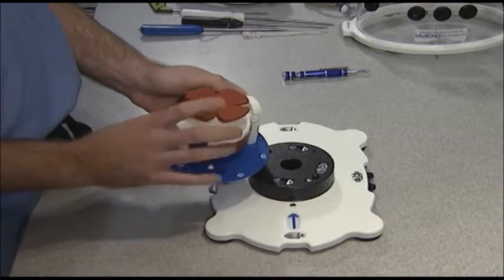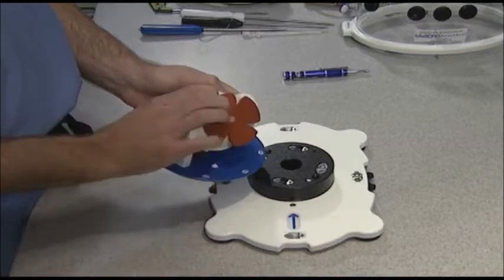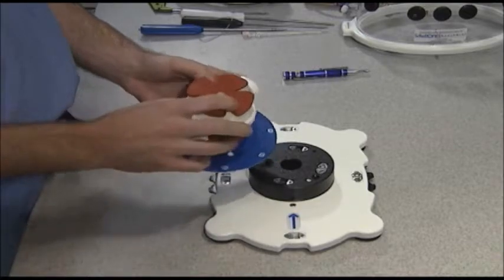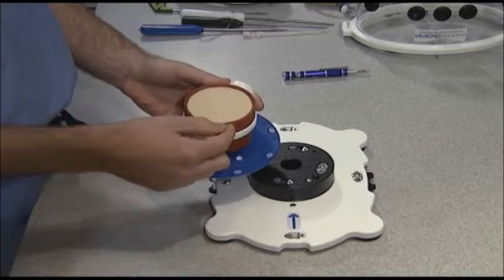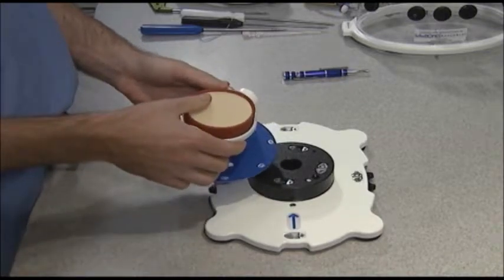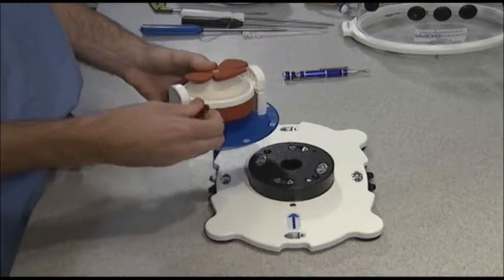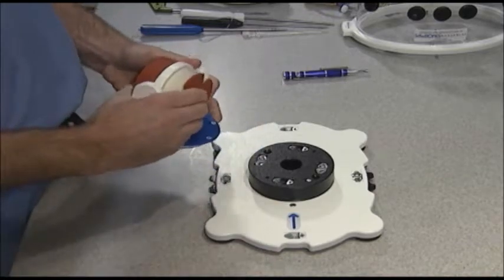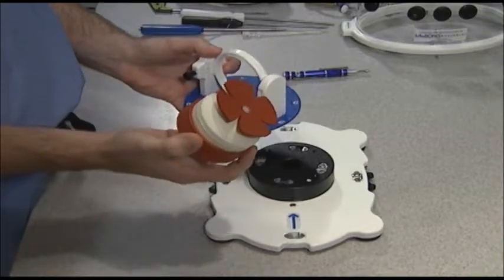There's a knob here which allows you to twist this. On the top, this simulates rotator cuff tears, and when you flip it 180 degrees, this simulates labrum and just cancellous bone. There's also another knob on the side here which you can untwist that allows you to load these pucks onto the workstation or onto the module should you need replacements.